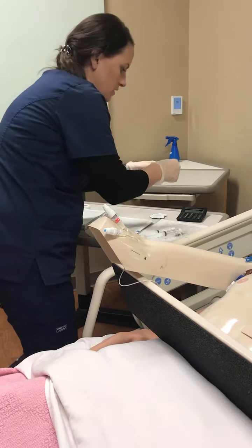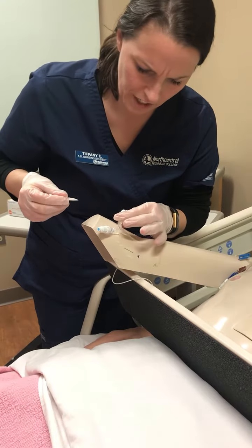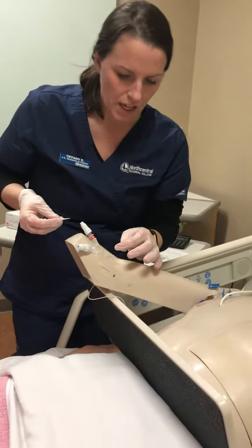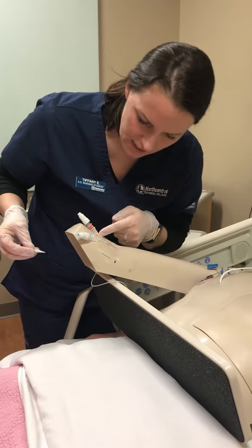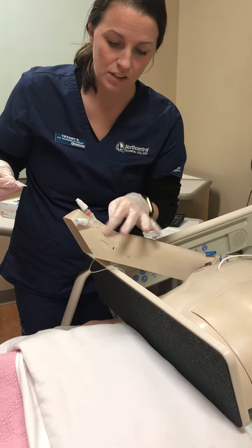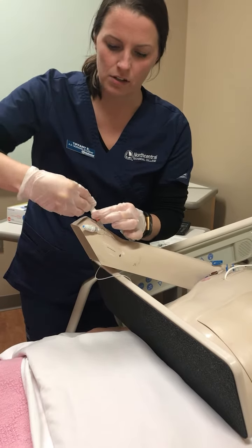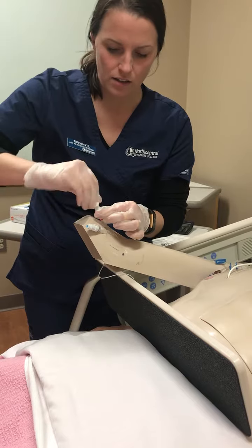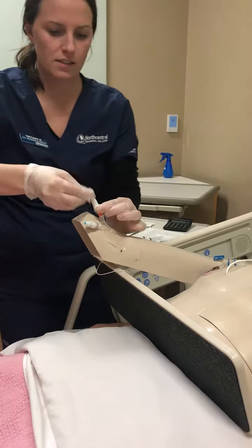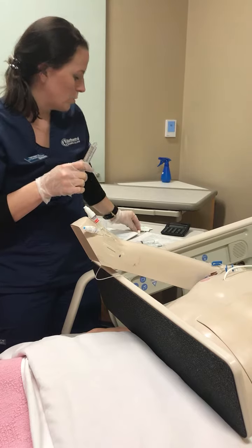Alright, so I'll go ahead and clean. I will be using the distal port here for the medication administration. I do not see that this has a clamp on it. However, we would clamp that. These would be clamped if they're not in use. So I'm going to go ahead and clean the port per agency policy for 30 seconds. Done so, and with that I can go ahead and get my normal saline ready.